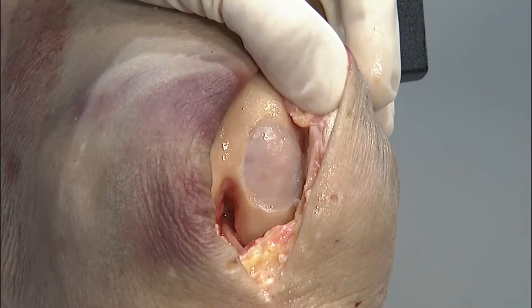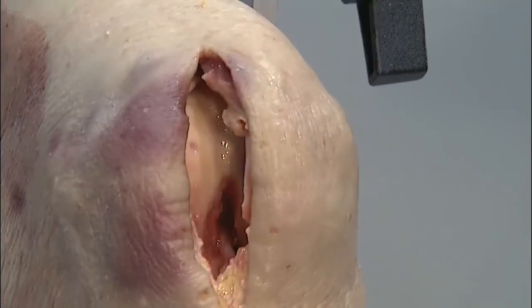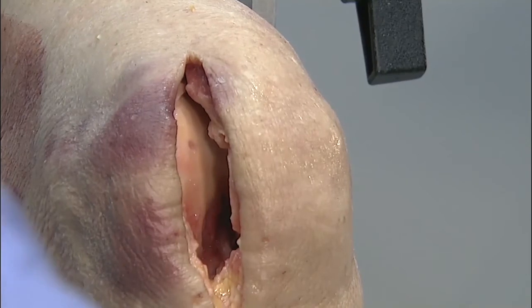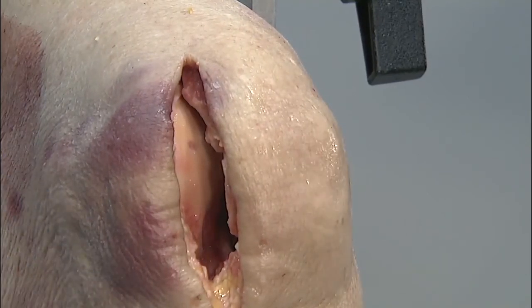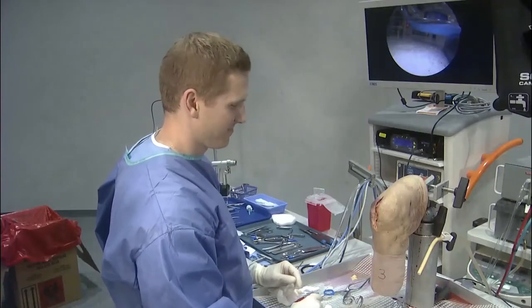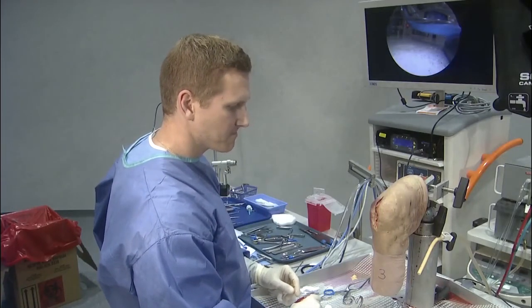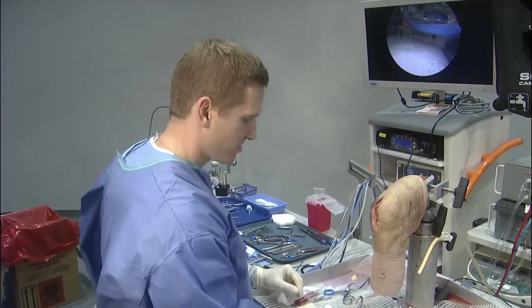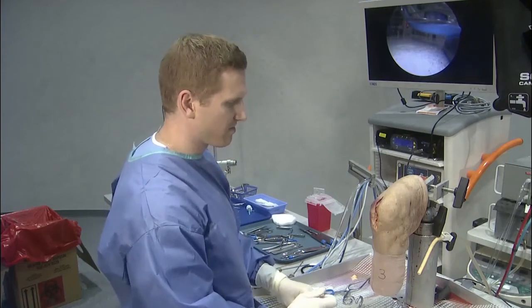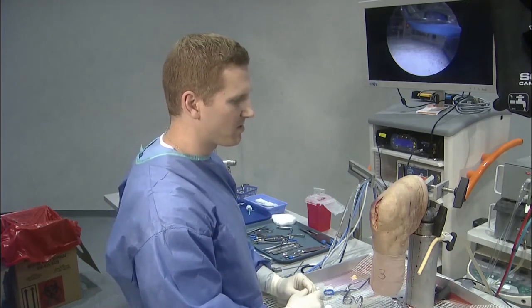Can you talk about, just because we do have a little bit more time unless we want to go to questions... see, the technique's too quick now. I know, right? Well, there's always stuff to talk about. But any difference in indications for you for patellofemoral joint versus femoral condyle? Are you putting this on the tibia ever? I haven't done any tibial lesions yet, but certainly theoretically with gluing the membrane you could.